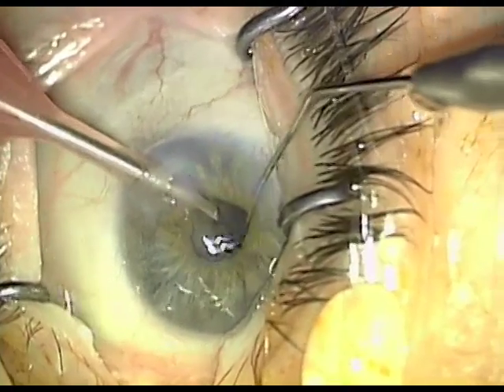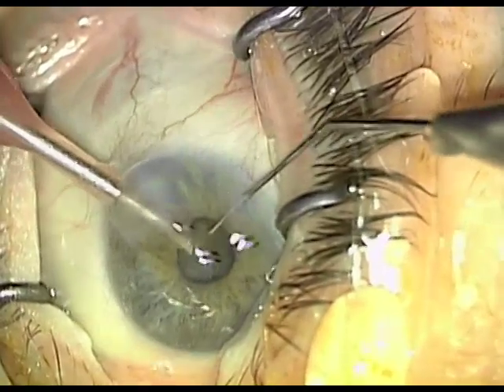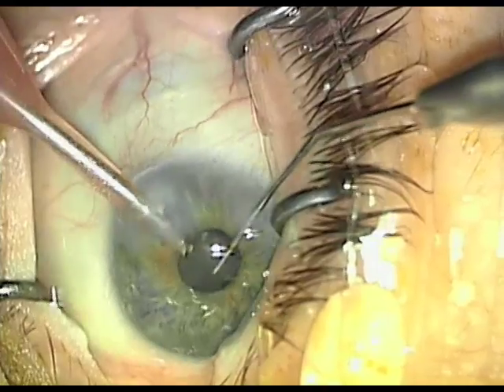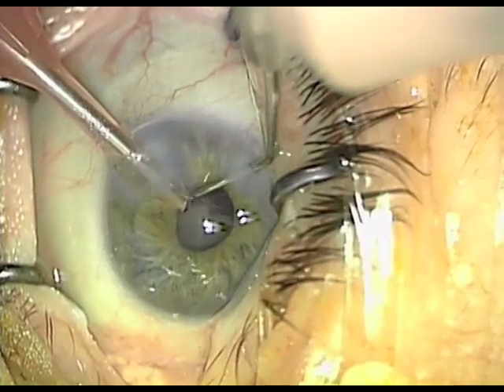That crack that you just saw must be achieved. If you cannot achieve good hydrodissection and you cannot achieve at least a hemi-nucleus crack, you will be required to stretch the pupil further or perform the surgery with iris hooks or some other method to increase visibility.